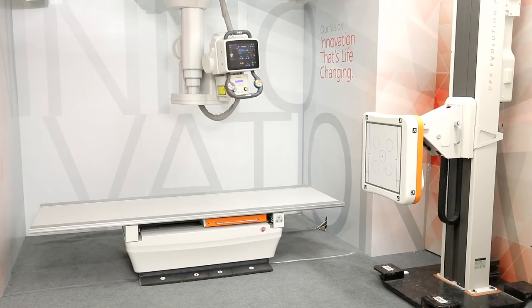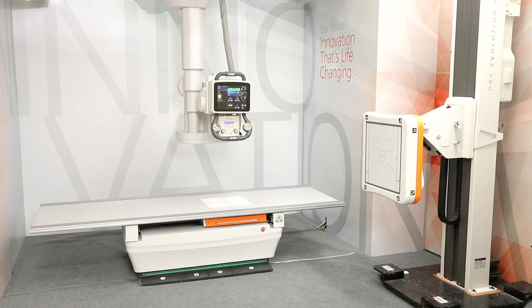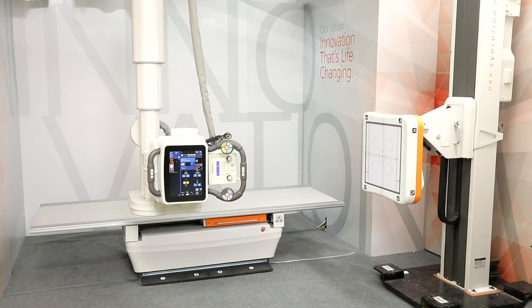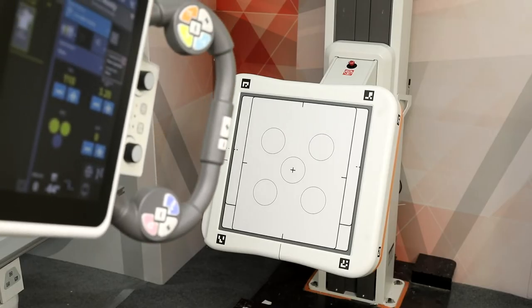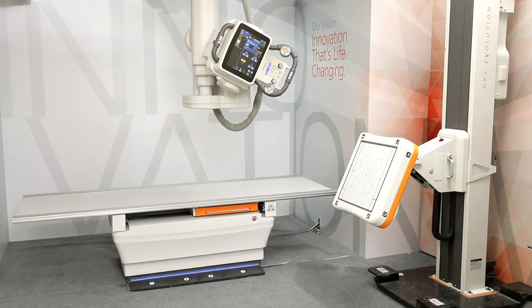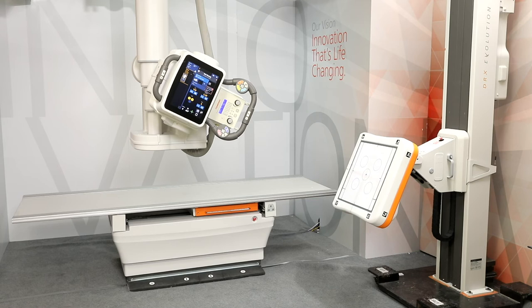The overhead tube uses automation to quickly and easily position to the table or wall stand. Auto-centering with perpendicular alignment is available at both the table and wall stand, even when the bucky is angled. Auto-tracking automatically tracks either the bucky or tube movement for fast source to detector alignment, available at both the table and wall stand.